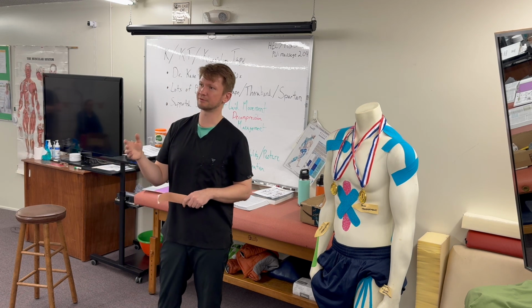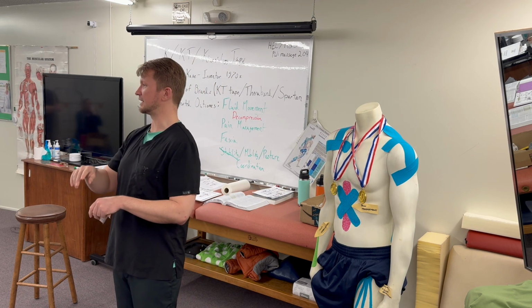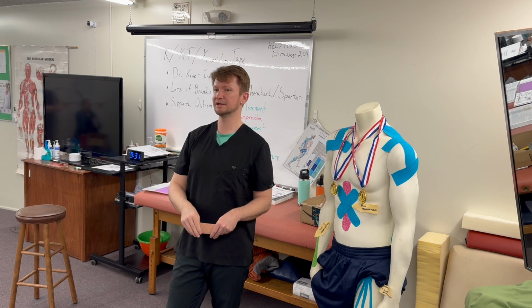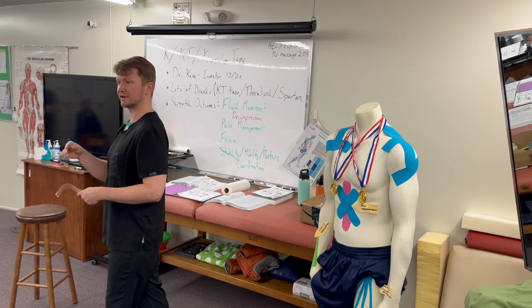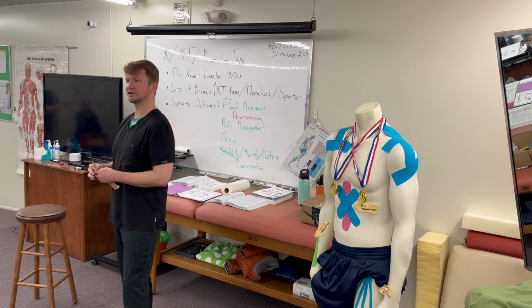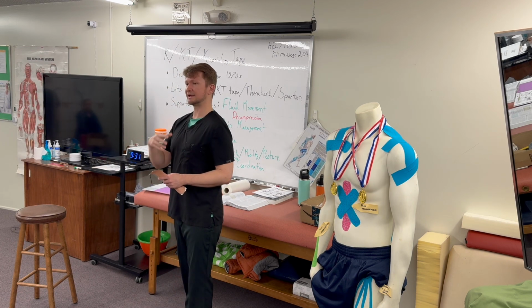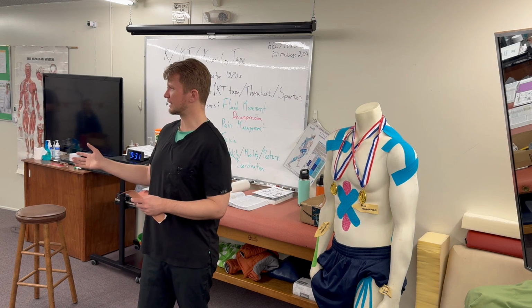If you want to think more from a financial, thrifty standpoint, getting the big roll that's uncut, you get more tape for your money, but then you have to cut it. You have the option to cut right there in the moment, which I got pretty good at, measuring on the person's body and cutting what I needed, but that can be an annoying, more lengthy process.